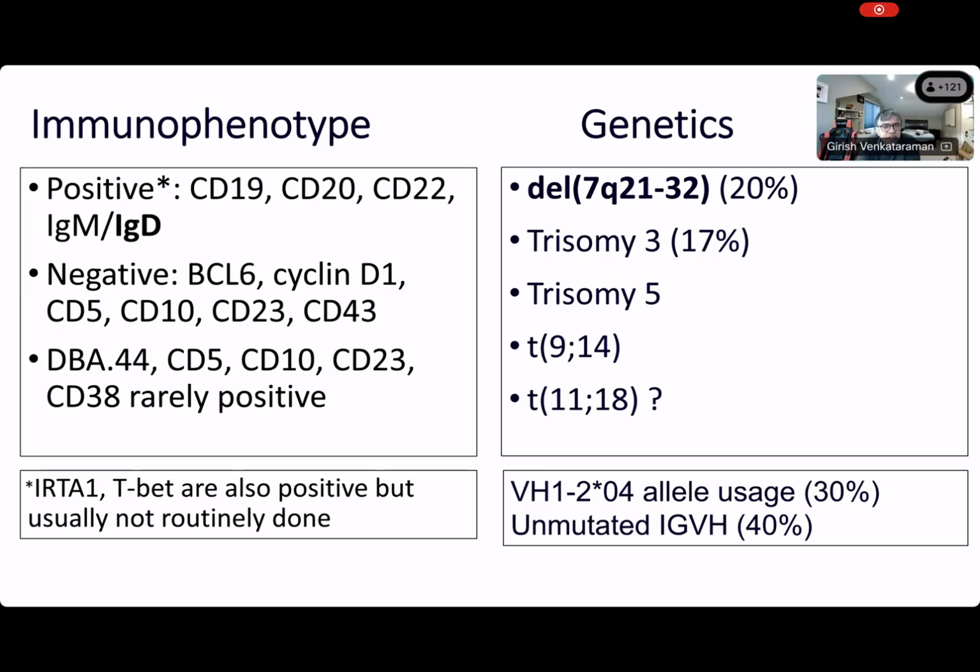This is actually an interesting question and offers a segue into histiocyte lesions. The second cell is the histiocyte, right? So normal histiocytes do use a lot of the MAP kinase pathway for their signaling. And cyclin D1 expression is usually a rough surrogate of an overactive or active MAP kinase signaling pathway. That's why you see staining in the histiocytes in a marrow. Normal plasma cells, no, they don't stain. But there's a class of myelomas where you have rearrangements involving cyclin D1 that will stain for cyclin D1, right? But normal plasma cells should not be staining for cyclin D1, although plasma cells do non-specifically absorb cyclin D1 all the time.